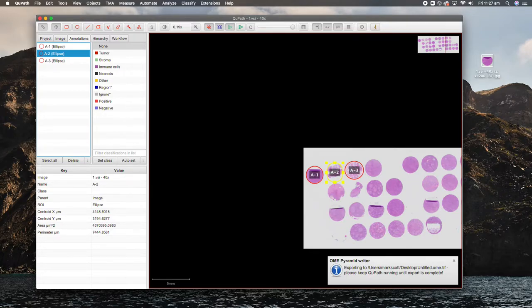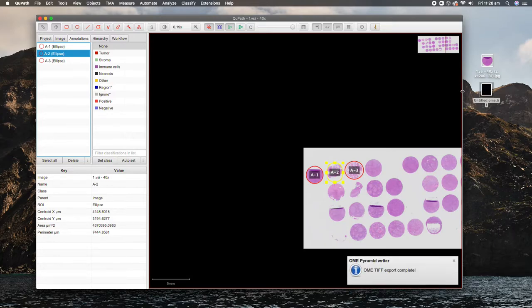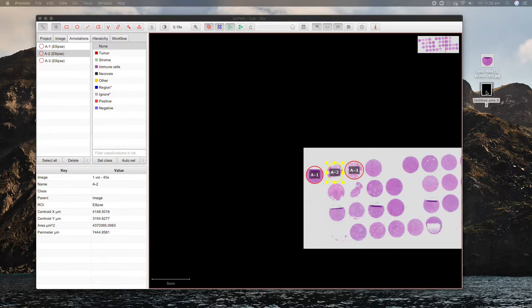So again, just drag that over. The OME TIFF you will then probably need to load into ImageJ in order to handle that file format. So we can probably get away with a JPEG, and with 2 times downsampling, if it is literally just to be able to send those out to whoever you need to send them to. Let me know if this is a problem.